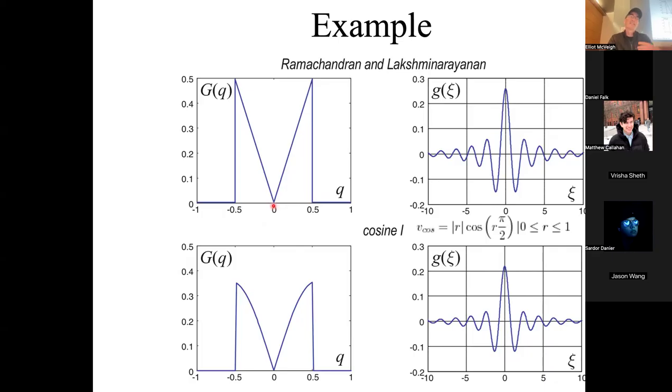And normally your object has a lot of spatial frequencies, and then they roll off themselves. And finally, you can't image any higher spatial frequencies with your detector and all of that stuff. And so it can even roll down here, but what's out here when the data is gone is noise.